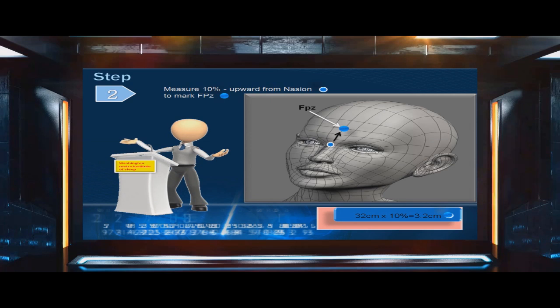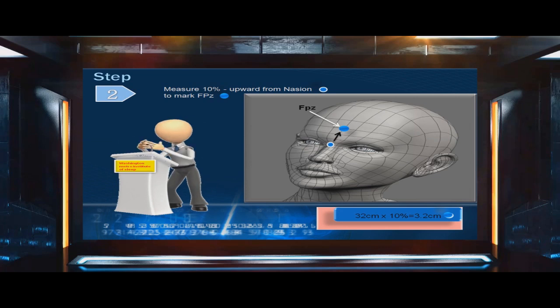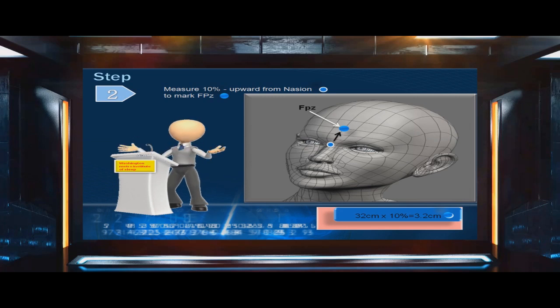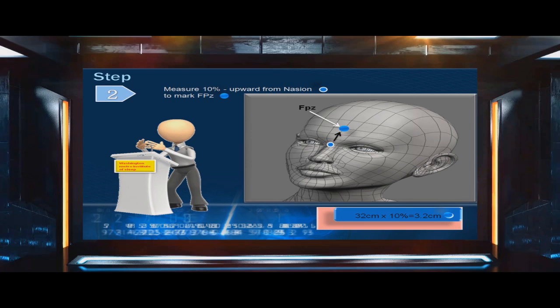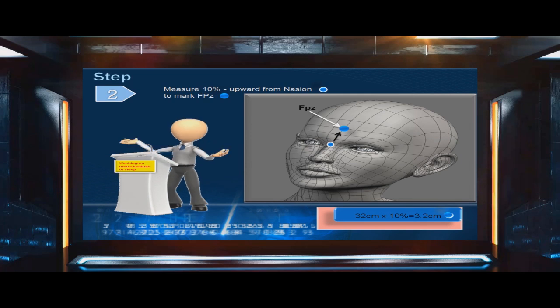Step 2: Measure 10% upward from the nasion to locate FPZ. In this example, 32 centimeters times 10% equals 3.2 centimeters.